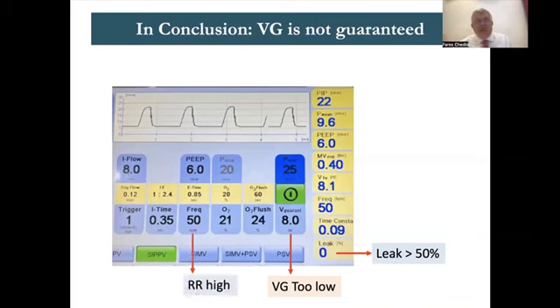As I said before, you need to look at the spontaneous frequency versus the ventilator. Here, the ventilator frequency is 50 and the patient frequency is 50. It's not good. If you set a frequency of 50 or 60, you don't allow enough time for the patient to trigger. Untriggered breaths need 2 to 4 centimeters of water more. So you need to allow the patient to trigger.